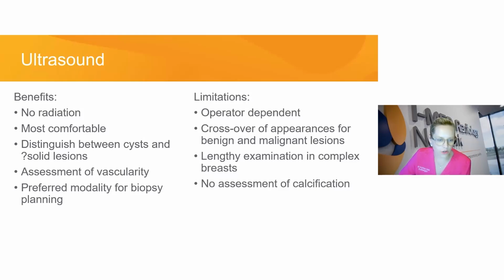We can assess for internal vascularity. So in the absence of contrast, where we are obviously assessing for vascularity, the ultrasound gives us a level of suspicion based on the vascularity within a lesion. It is our preferred modality for biopsy planning. So when we find a lesion under any other modality, we are searching very hard for any sonographic abnormality. Women much prefer an ultrasound-guided biopsy.